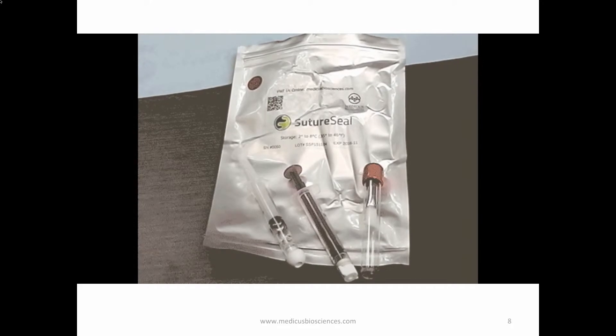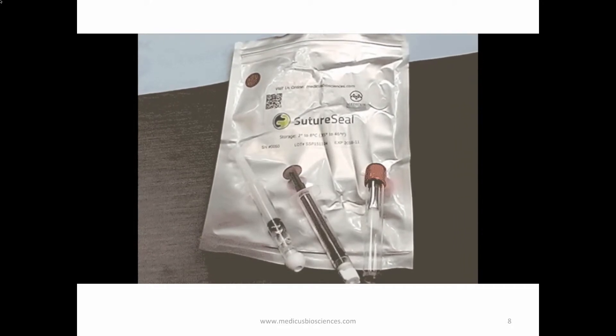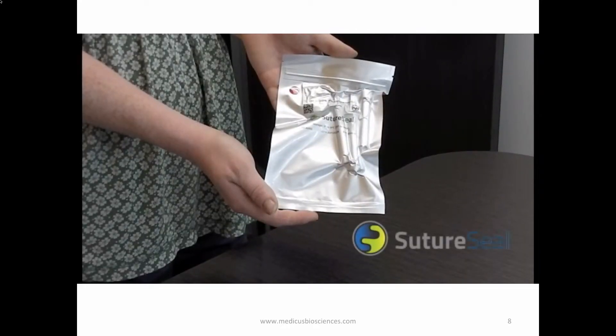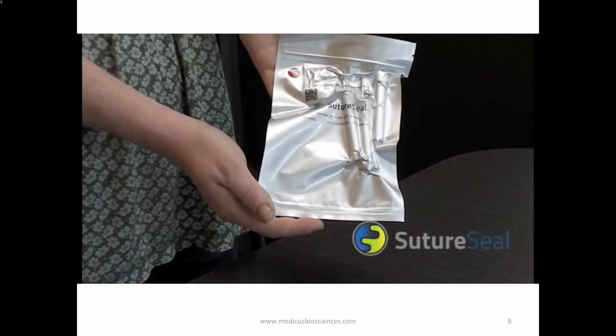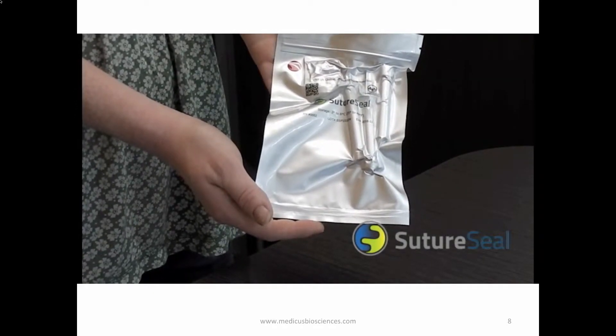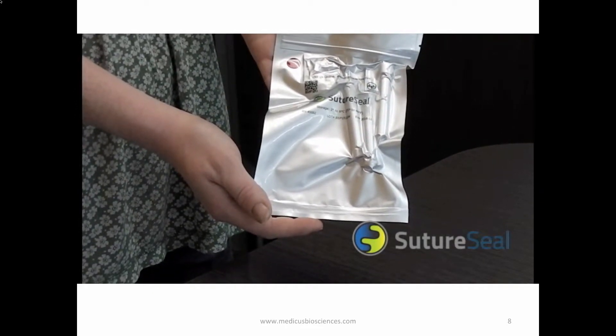Introducing SutureSeal from Medicus Biosciences. These are the directions on how to properly mix SutureSeal. In this video, we are using a single SutureSeal packet that contains enough polymer for a 15 cm long suture or equivalent square wound area.